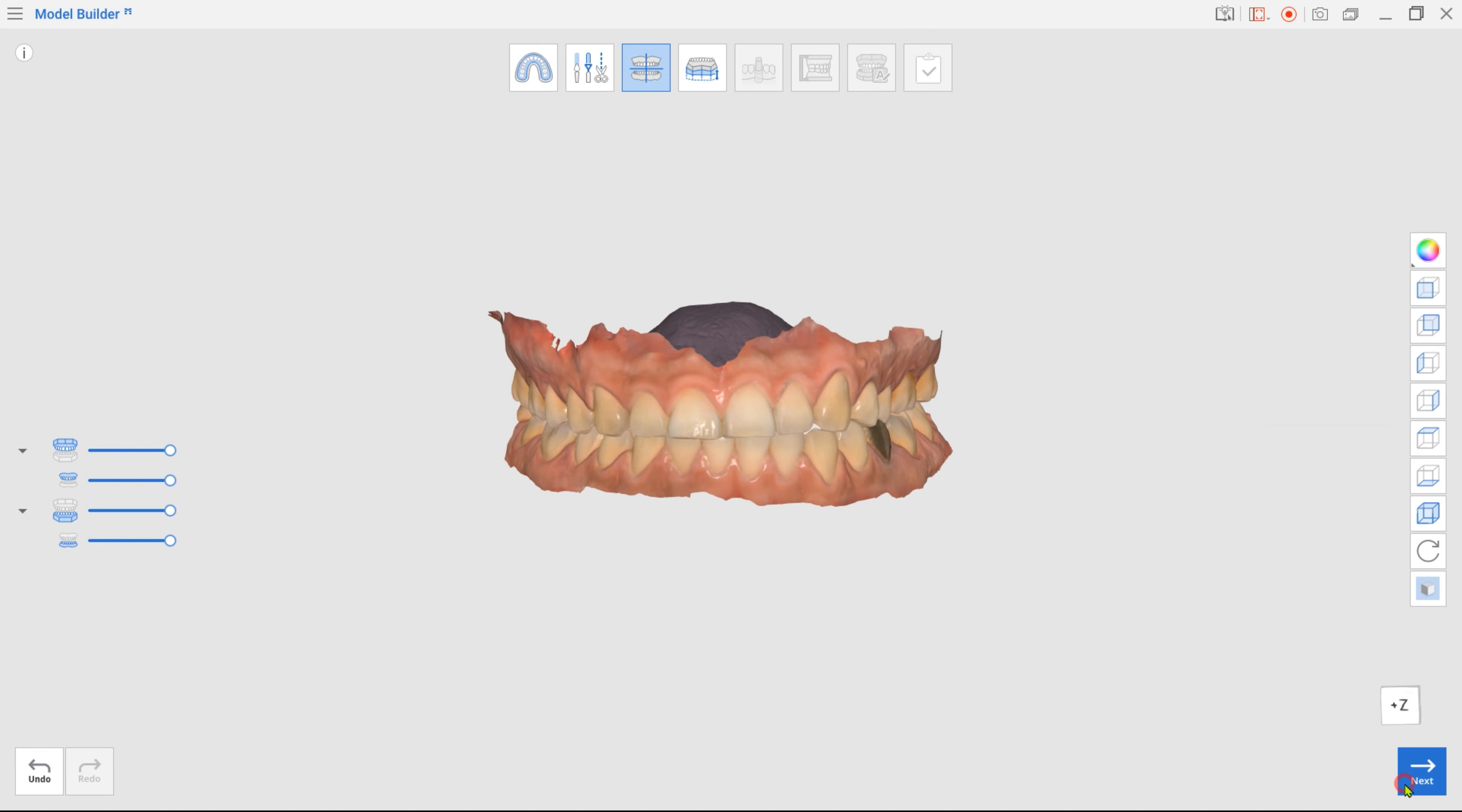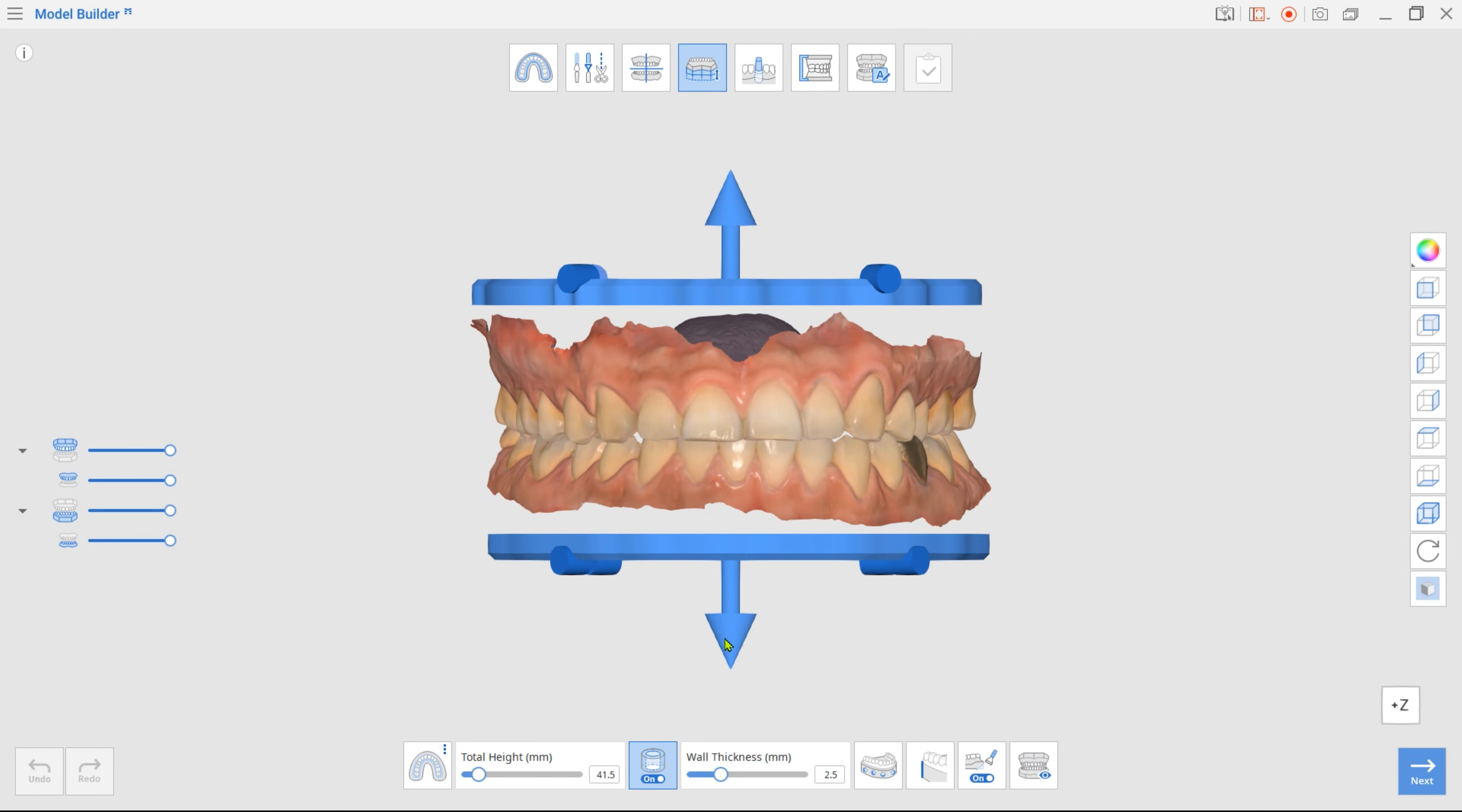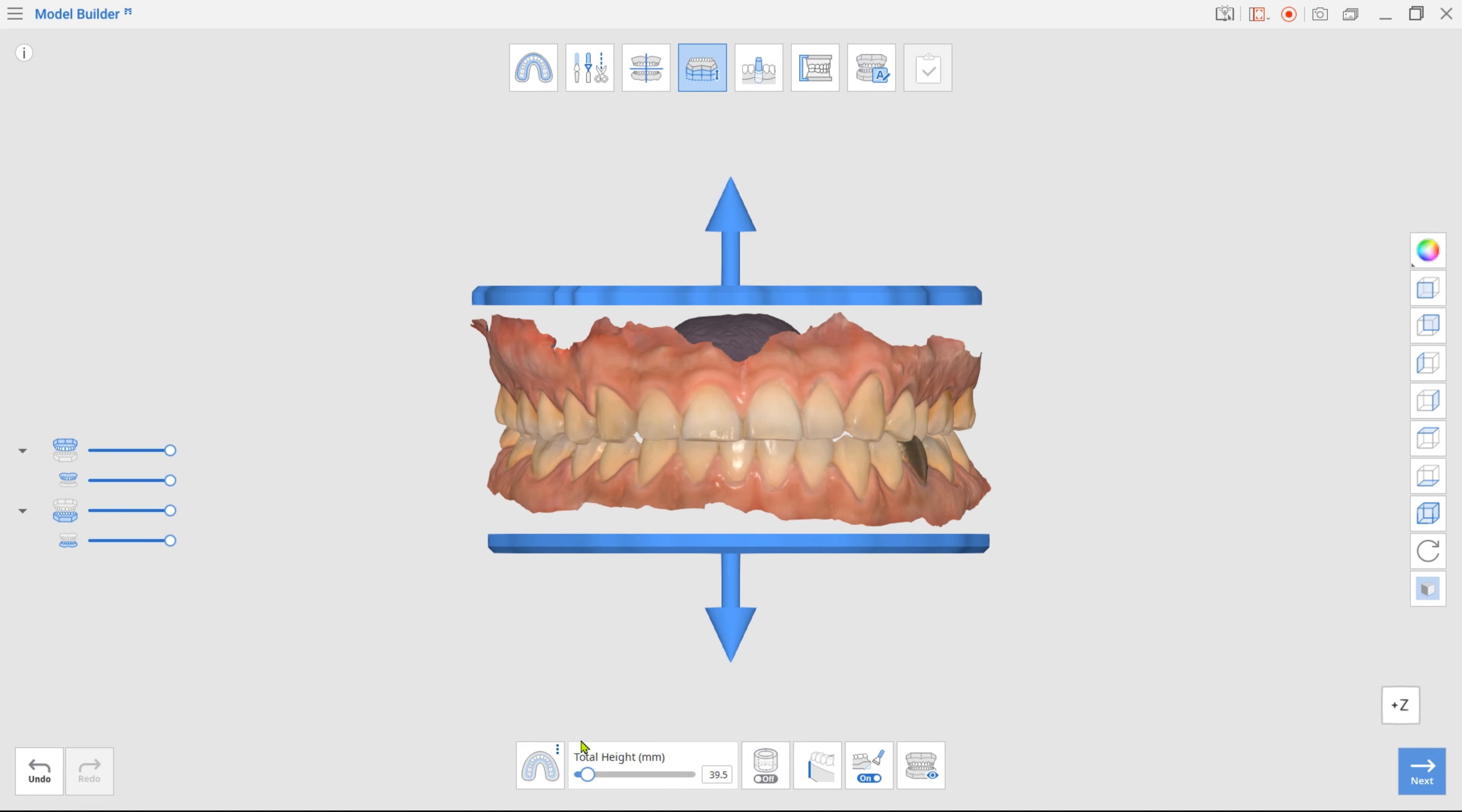Next, we have Base Creation mode. Drag arrows up and down to adjust the base height and turn off the hollow shape option. Don't forget to select the ABO Base Type in the toolbox below.